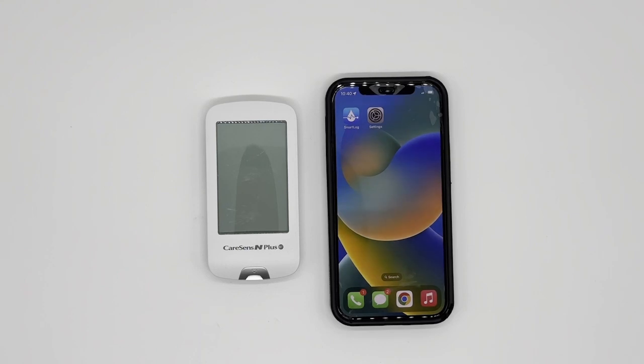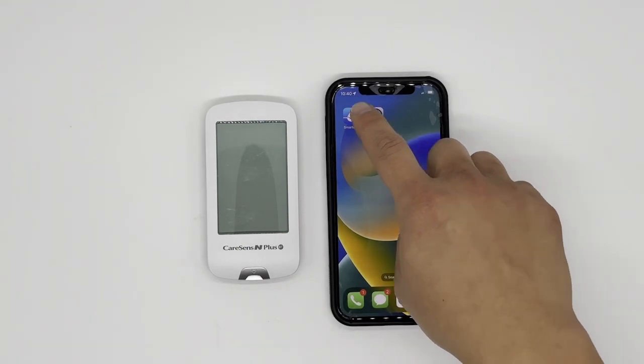The first step is really for those who have been trying multiple times and keep on failing and wonder why. This first step will definitely help you. So first of all, let's go to SmartLog.